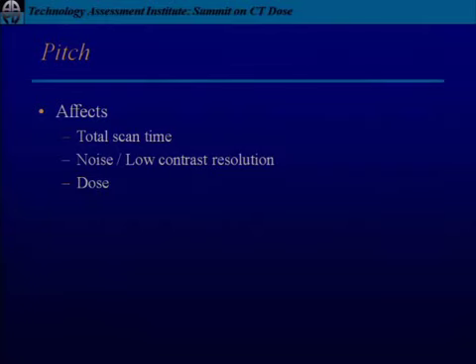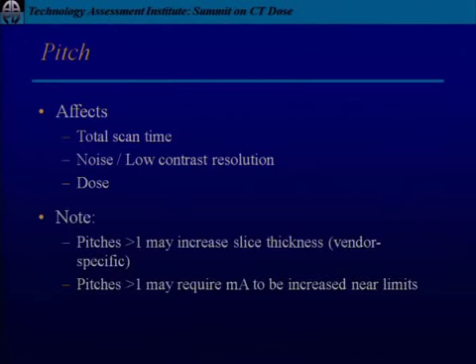It also will affect how many photons can be thrown into any given slice, whether or not that slinky is pulled apart or compressed together. So it will affect your noise and your low contrast resolution, as well as your dose. A few things to be aware of here. Pitches that are greater than 1 may show a slight increase in slice thickness.